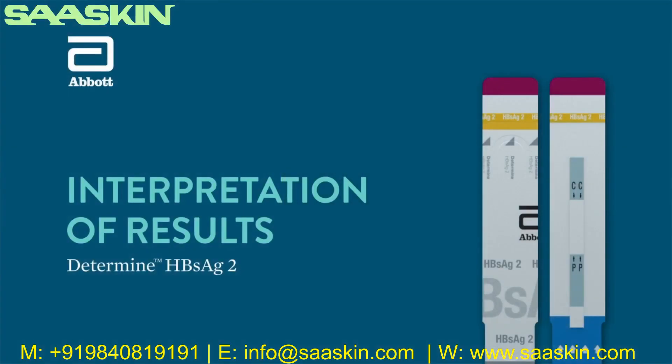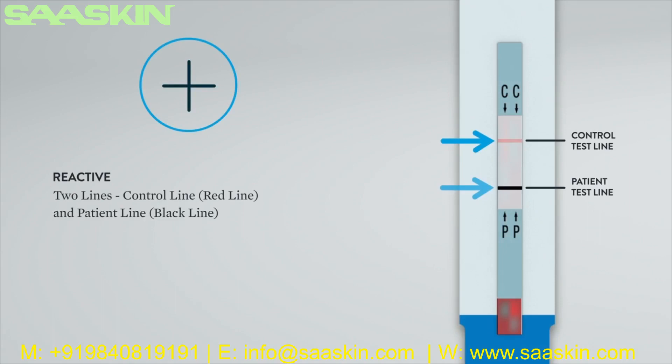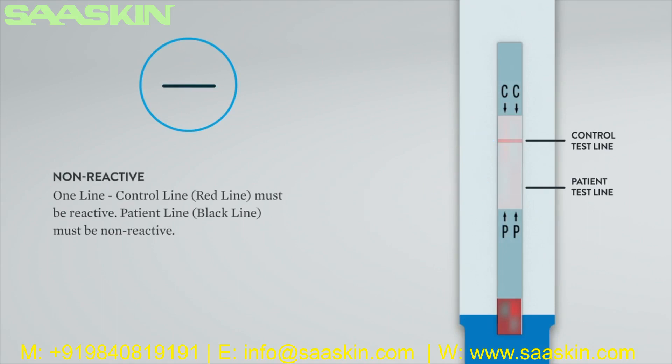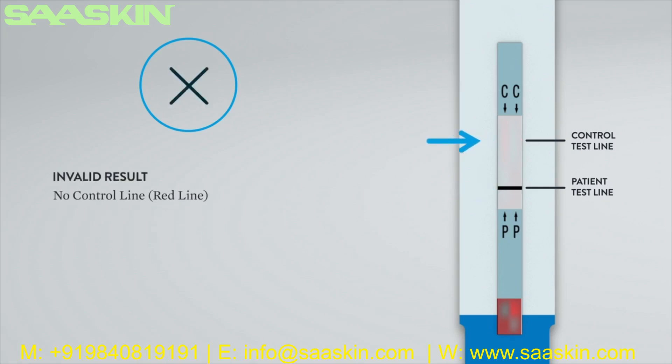Interpretation of results: Hepatitis B surface antigen reactive — two lines: control line (red line) and patient line (black line). For a valid non-reactive result — one line: control line (red line) must be reactive, patient line must be non-reactive. Invalid result — no control line or red line. The result is invalid and the test should be repeated. If the problem persists, contact technical support.